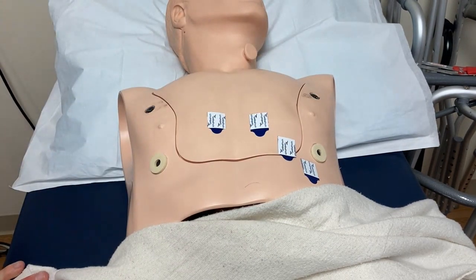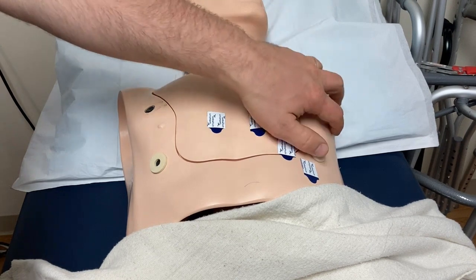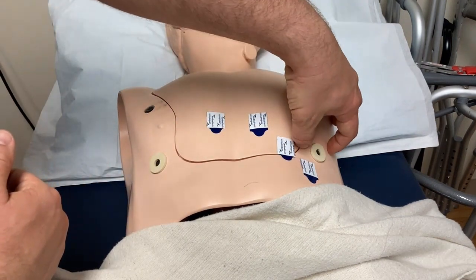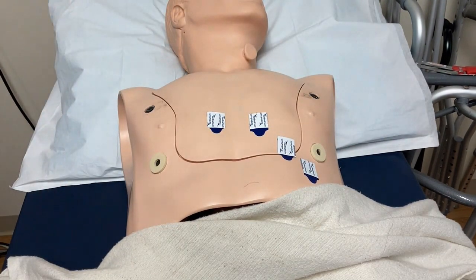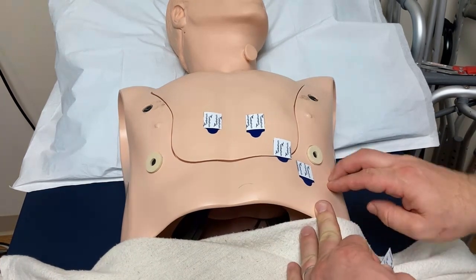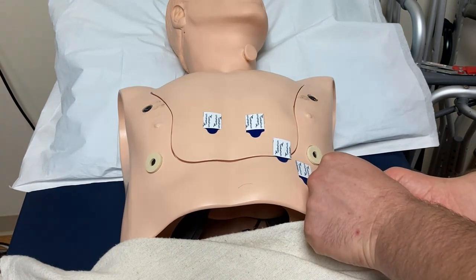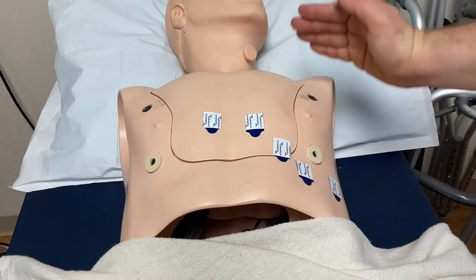For women, work around the breast — still use the mid-clavicular line, but don't place the electrode on the breast because breast tissue doesn't conduct electricity well. For men with large muscles, same idea — work around the muscles. For V5, go to the anterior axillary line, which is the front armpit line. On thicker patients, feel where the chest starts to curve significantly — that's your front armpit line. V5 is at the same vertical level as V4.